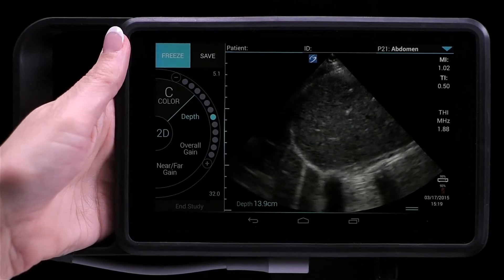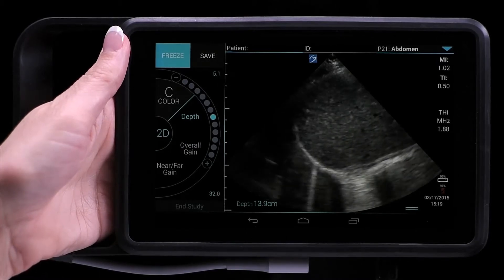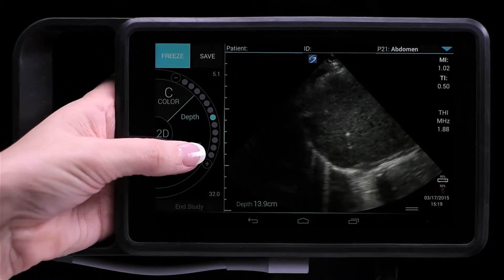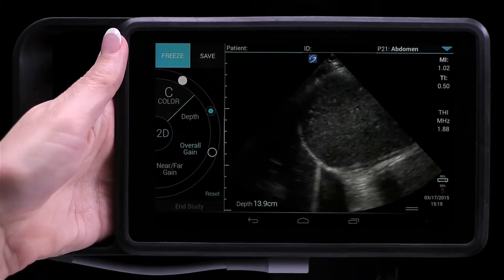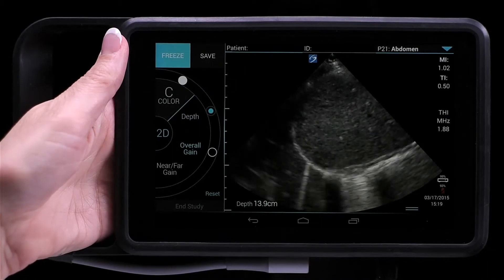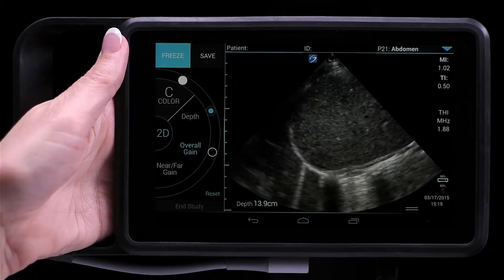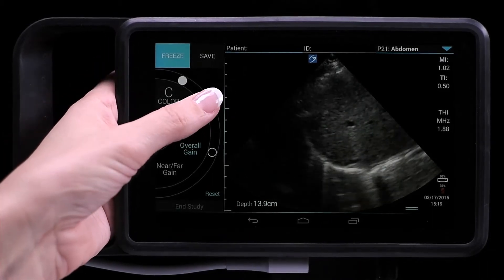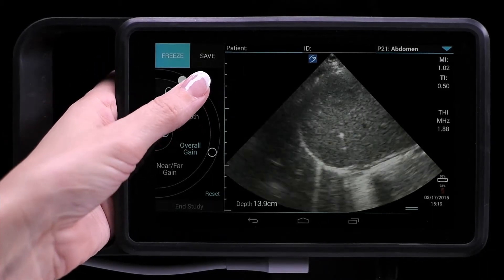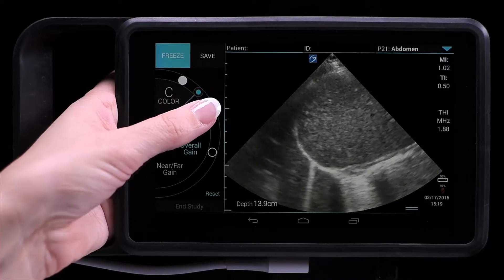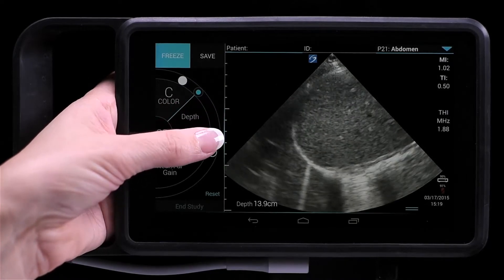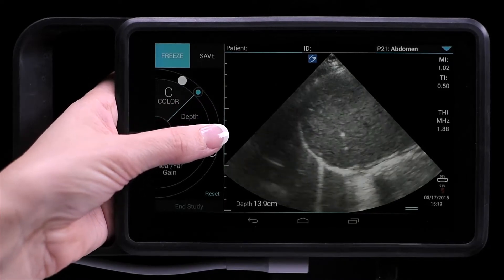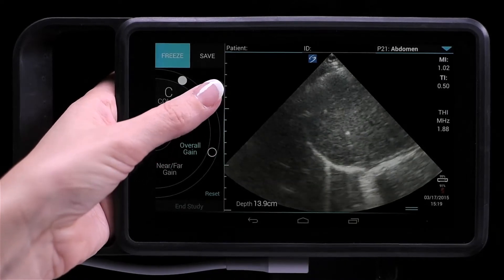The overall gain is adjusted by tapping Overall Gain on the control wheel, and then moving the blue dot up and down the slider, or by tapping a specific spot on the wheel.